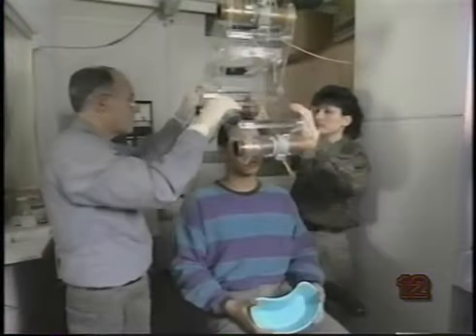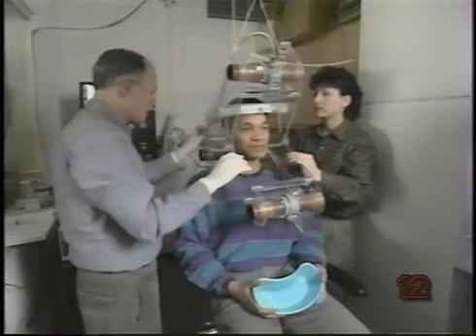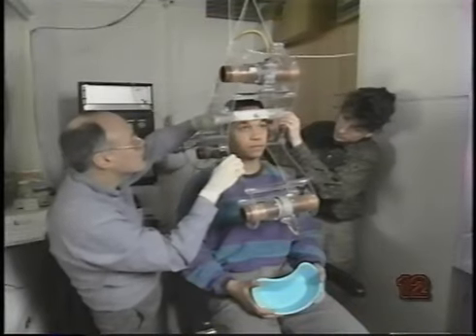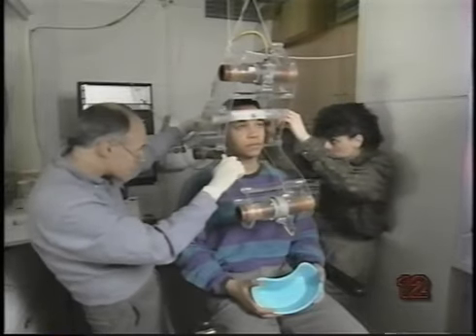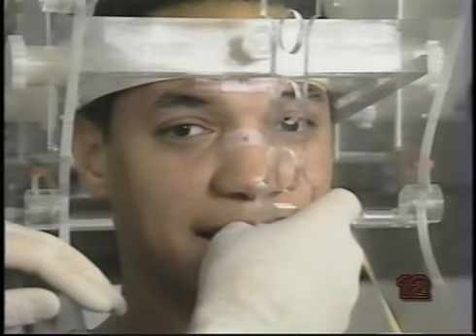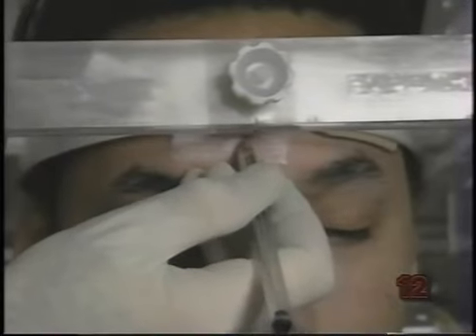The subject is seated in a comfortable position, and the transmitter assembly is placed over and secured to his head. The assembly is positioned vertically and horizontally, so the center of the measurement plane coincides with the subject's oral cavity. We check and adjust the alignment of the assembly midline with the subject's mid-sagittal plane, using the midline pointer being manipulated by the experimenter. Then we put midline marks on the subject's face as a guide to transducer placement.